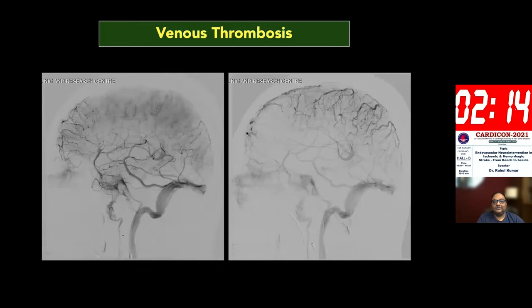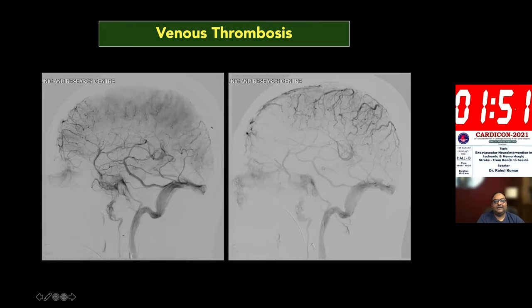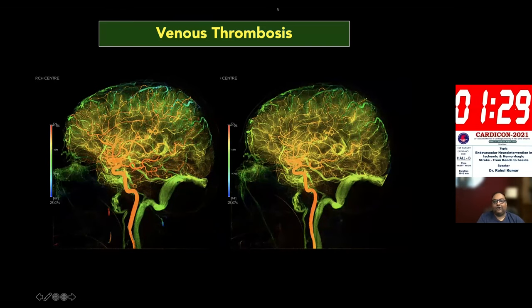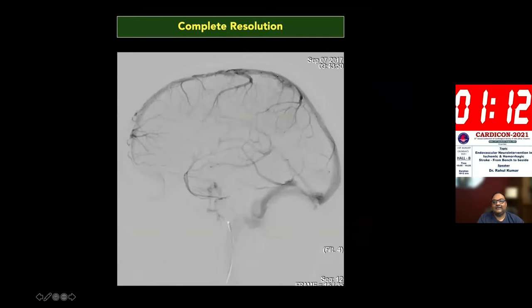Venous thrombosis is also important and not easily diagnosed. Severely dehydrated patients or those with hyperhomocystinemia may present with neurological syndromes not responding to routine management. On angiography, the entire venous outflow may be blocked. In such patients, we take a microcatheter into the superior sagittal sinus, perform thrombectomy, leave the catheter there, and infuse urokinase for 10 to 12 hours. The occluded sinus opens up, as confirmed on follow-up angiography. A perfusion map on the cath table shows that even a two-second improvement in cerebral blood flow can bring a patient from GCS 5 to GCS 13.